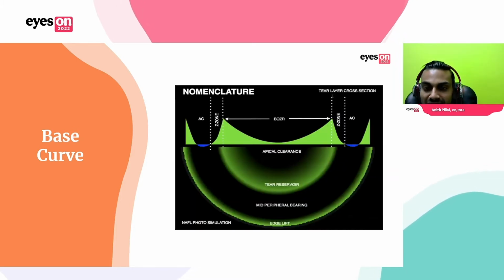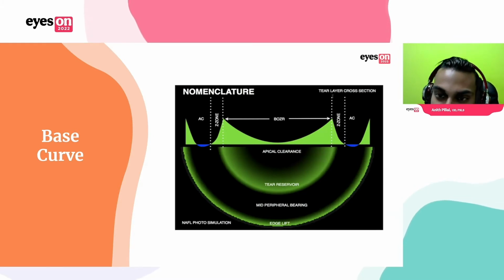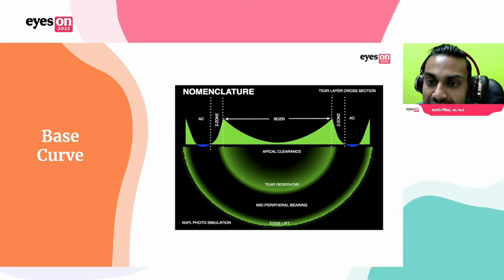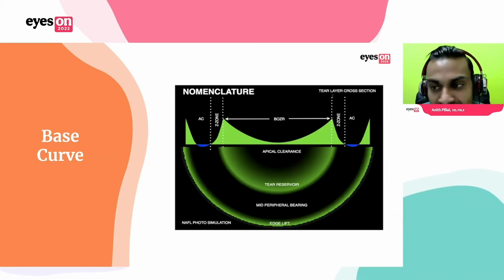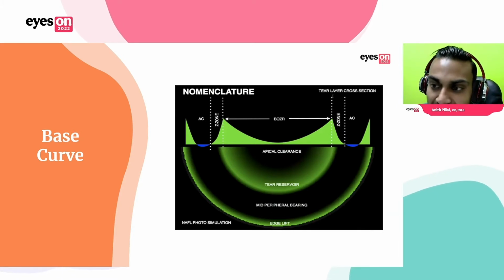And this is what the tear layer looks like underneath the lens. You'll see underneath that base curve, which looks like bearing on the bottom half of that image, that there's actually a very thin layer of tears, about 5 to 10 microns, depending on the myopia you're correcting. So we don't want compression. In fact, if we start to see epithelial disruption or central keratitis, that's a poor fitting design, and we need to make modifications to that. So you'll have this thin layer in the base curve.